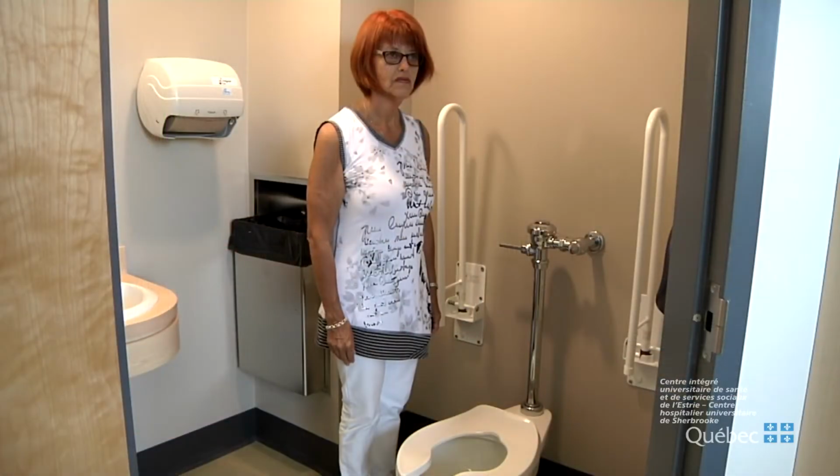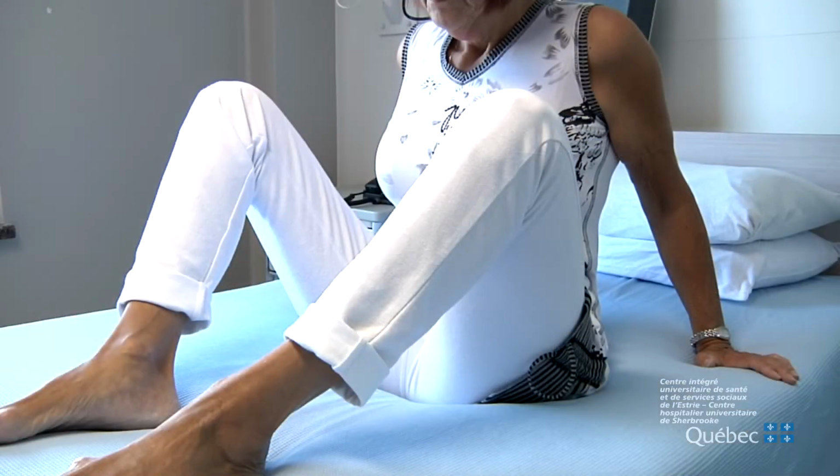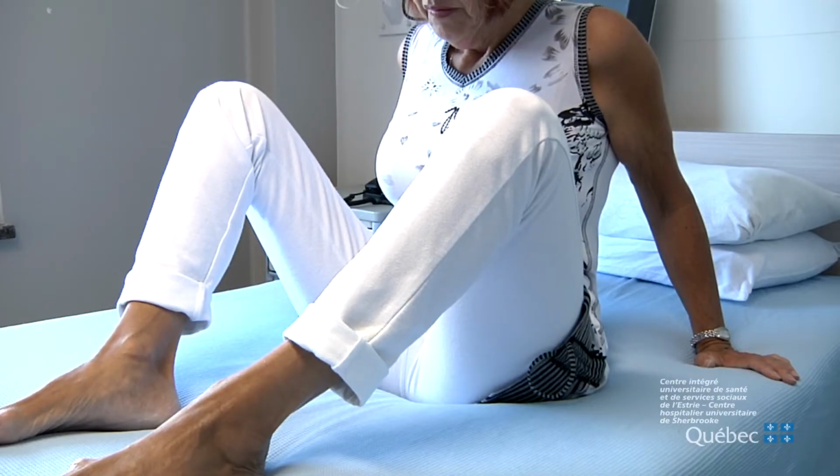Pick a spot with good lighting where you will feel comfortable performing the self-catheterization. You can choose one of these three positions. Standing near the toilet, sitting on a chair facing the toilet or on the toilet, sitting on a bed with your legs positioned as if for a gynecological exam.